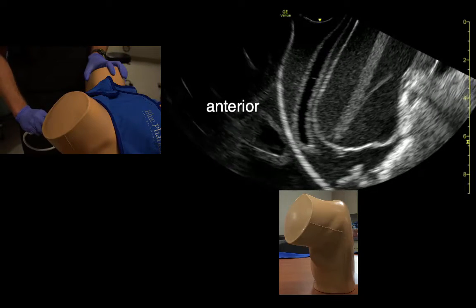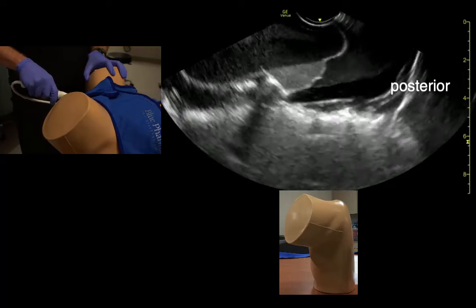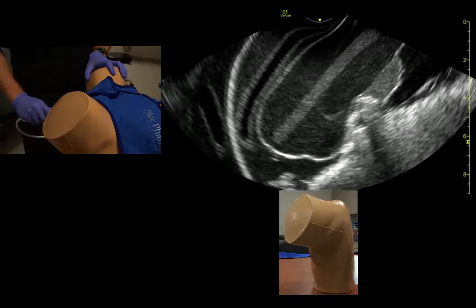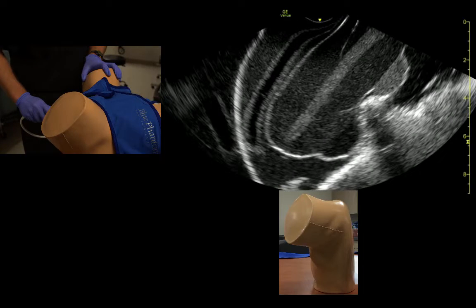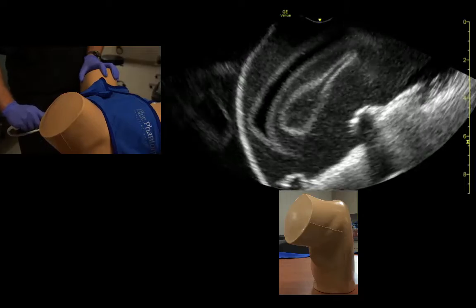These are anterior structures up here. When we point the probe down towards the floor, we see posterior structures. We want to line up so that we see the uterine fundus and the endometrial stripe, and then to examine those structures, we fan from side to side until those structures disappear.